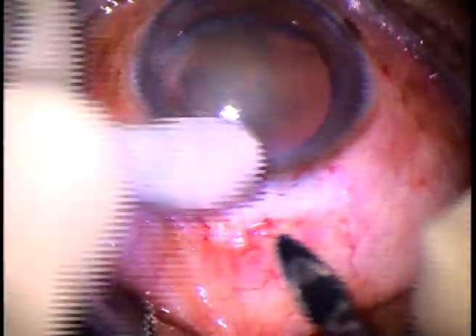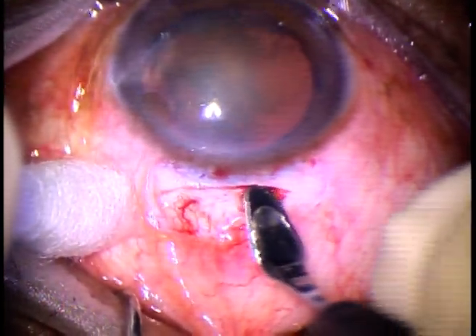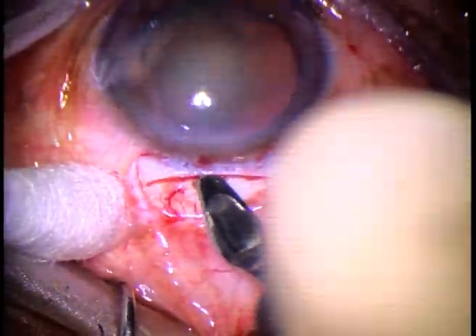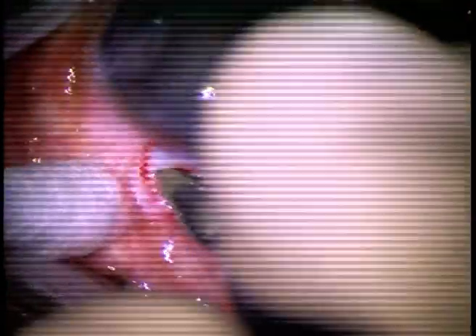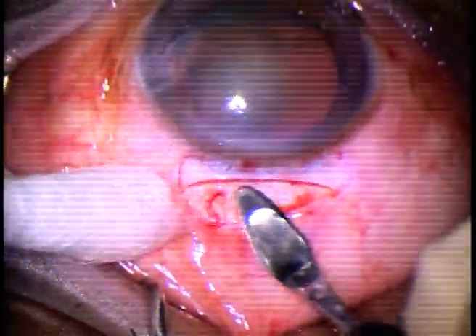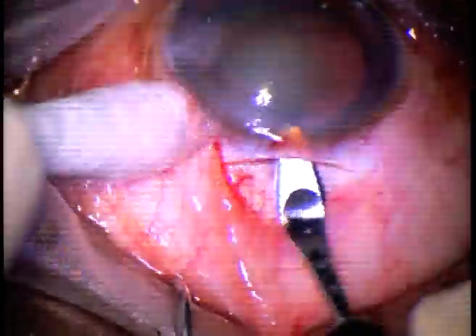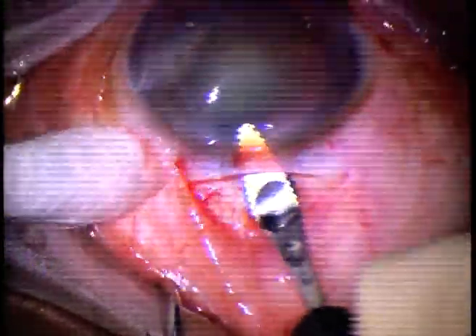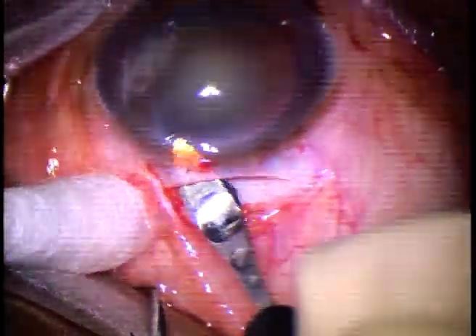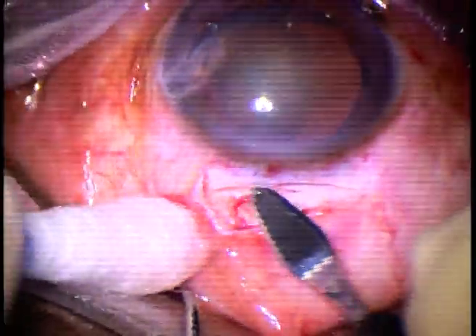This is a crescent blade. The dissection must be carried out at a certain depth, almost half thickness of sclera. Go at the middle, anteriorly, into clear cornea.